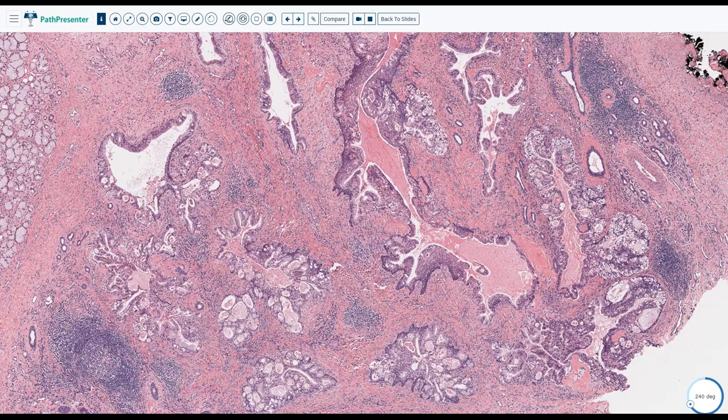So you just don't put your money on that part. Any immunostain you'd like to order? You can of course use mucicarmine for solid areas that you want to be squamoid area, mucocytes, mucicarmine can help. But immunostains overall don't help much.